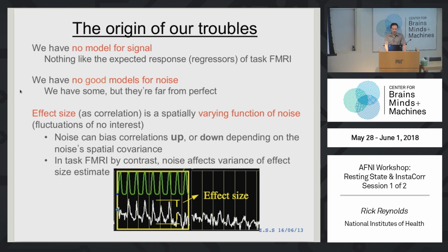So a lot of these slides are basically complaining about issues we have to worry about with resting state analysis. And in particular, we get into global signal regression later. But I think for the most part, you here have a decent idea of what we care about here and what we don't care about here. So I'm not going to spend too much time following all these.